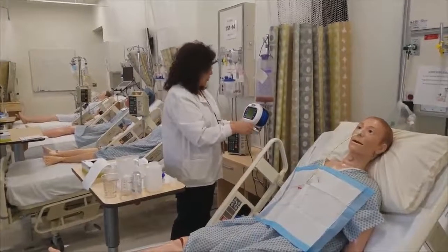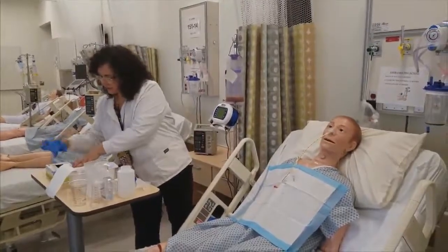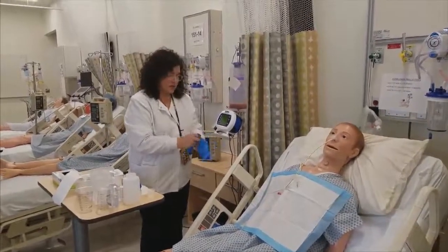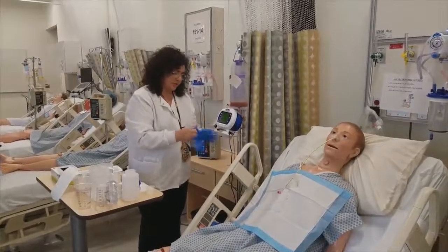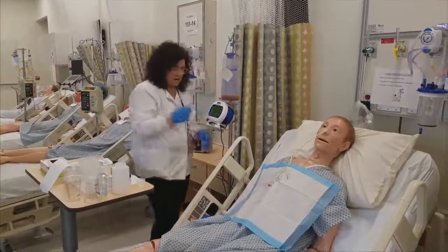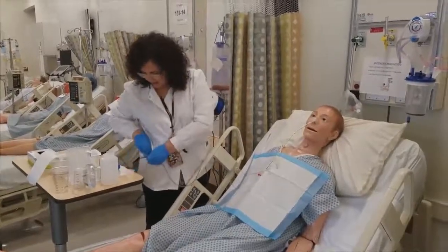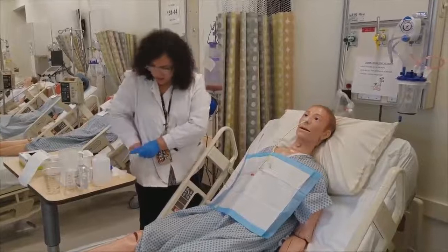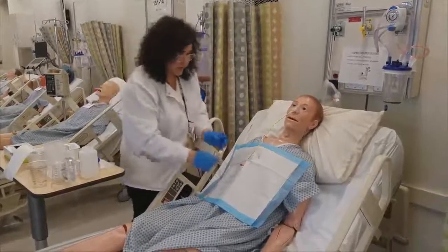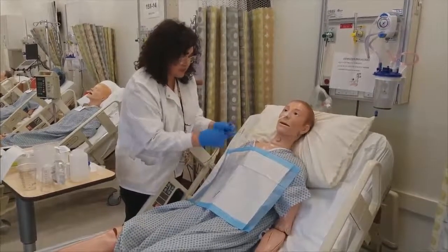And then I'm going to put some new gloves on here and attach it back to the patient. Always a good idea to decontaminate the end of my feeding tube before I make the attachment.